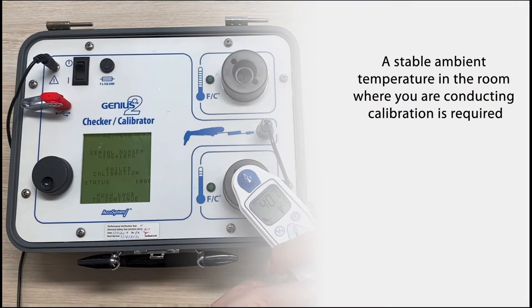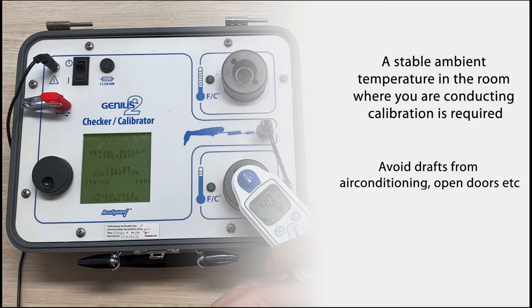It's really important to make sure you have a stable ambient temperature in the room where you're doing the calibration. Drafts from air conditioning, in addition to the actual room temperature, may give you some problems and you will get error 6, which is the ambient temperature out of range error, or the calibration will fail.